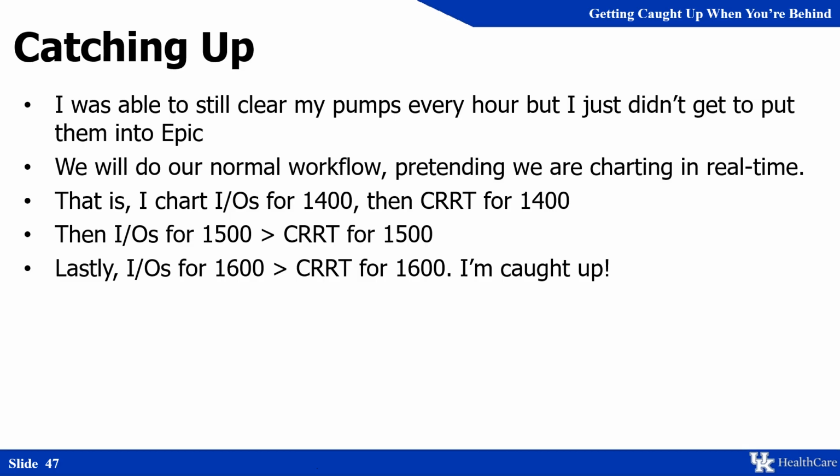So as I kind of mentioned in the previous slide, you do everything for 2 o'clock on I's and O's, then 2 o'clock CRRT, 3 o'clock I's and O's, 3 o'clock CRRT, 4 o'clock I's and O's, 4 o'clock CRRT. Is it tedious? Yes. But will it work every time? Also yes.